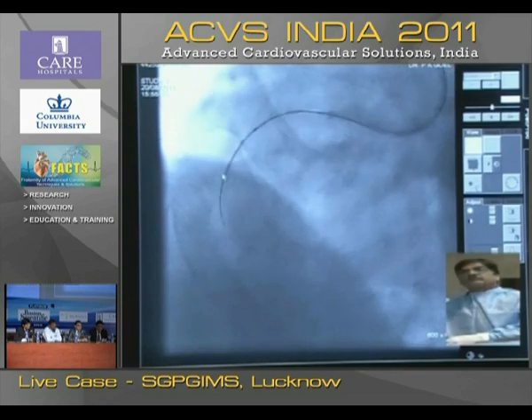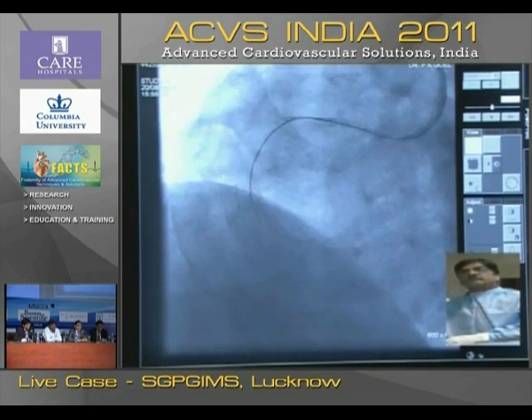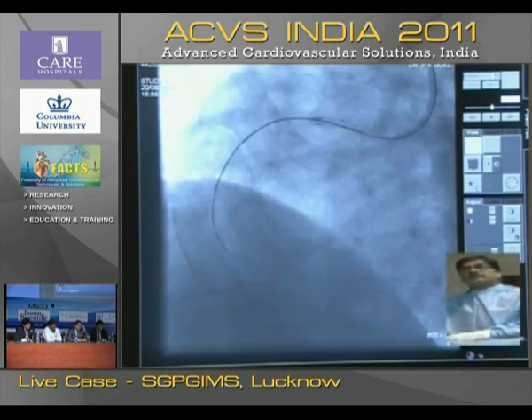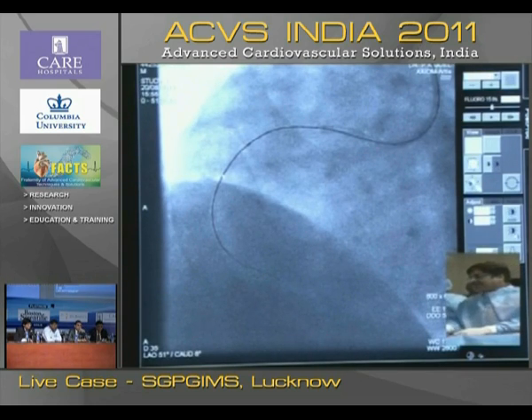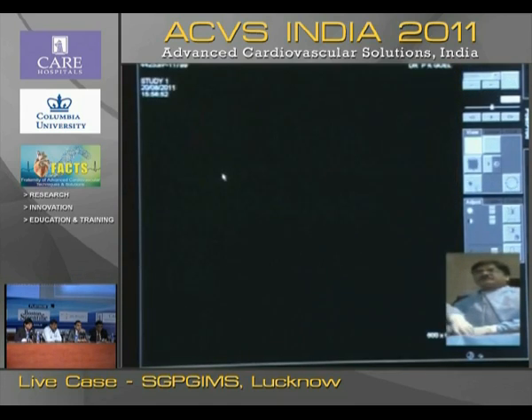Because the other thing is, if it were in the false lumen, it would have given me resistance. It is not giving me resistance, and I am proceeding in the curve of the artery. So I think probably it is inside. We'll confirm it now. Angio. Okay, so that's the LAO, and now let's see the RAO.